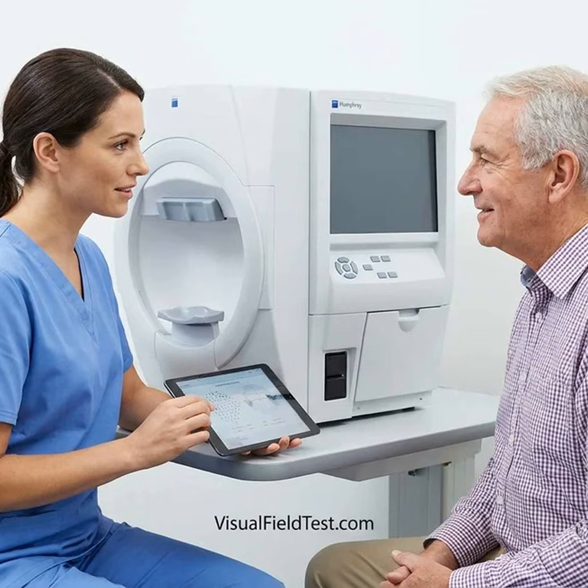Use one short practice session, but do not treat the practice result as a medical result. Test when you are alert rather than immediately after strenuous activity or a poor night's sleep. Use reminders if the program provides them. Record unusual circumstances such as headache, dizziness, illness, poor sleep, or difficulty keeping the head still. Stop and contact the clinic if the device causes significant dizziness, nausea, headache, or visual discomfort. Upload or send the results as instructed.